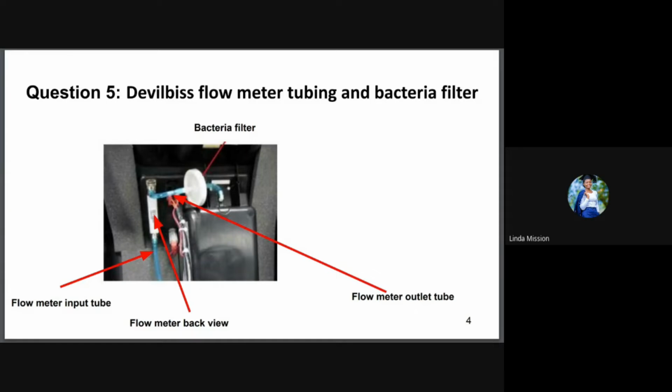The first thing to do is to check for leakages in the airways, starting from the patient outlet down to the product tank. To check for these leakages, disconnect the tube from the flow meter outlet as shown in the graphics, that's the tube that has the bacteria filter and the check valve.